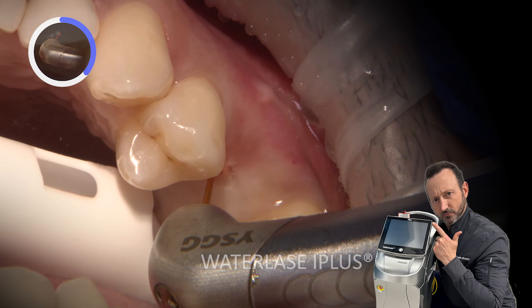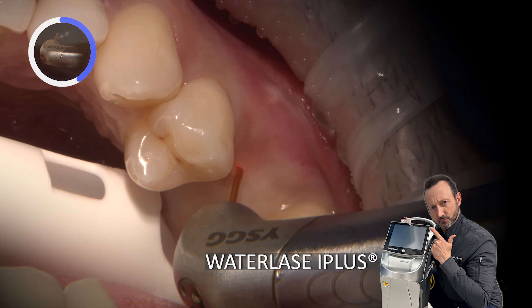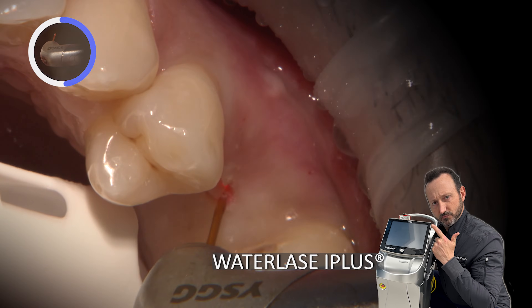For this uncovering, I am utilizing BioLase's WaterLase I+, which is an Erbium Chromium YSGG laser.